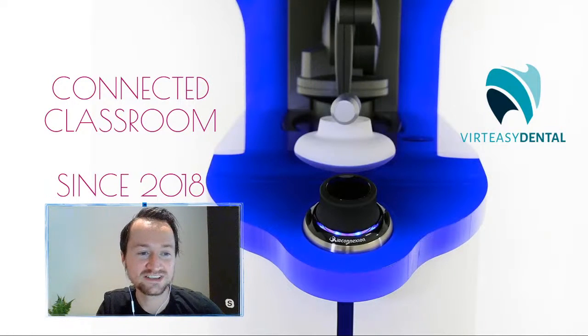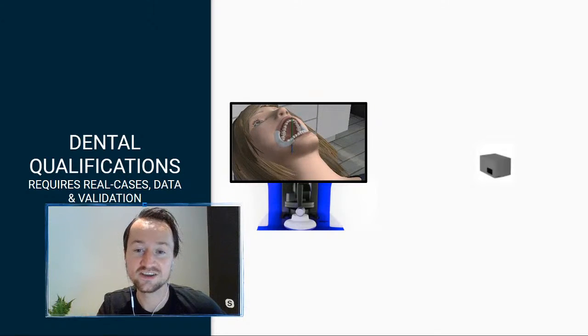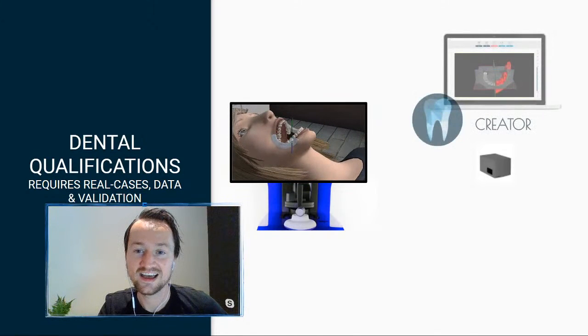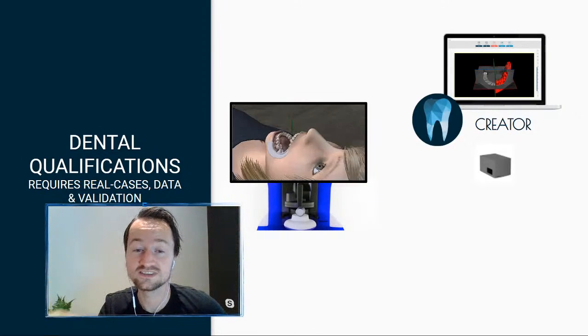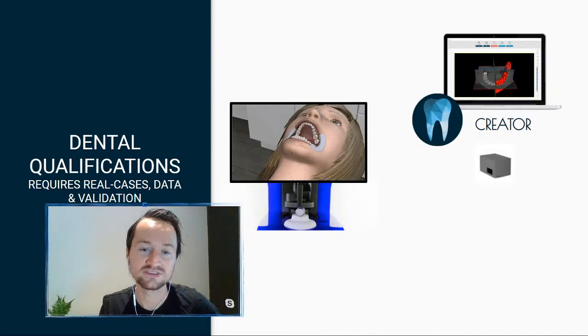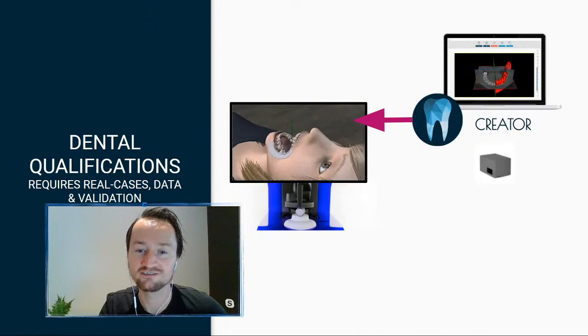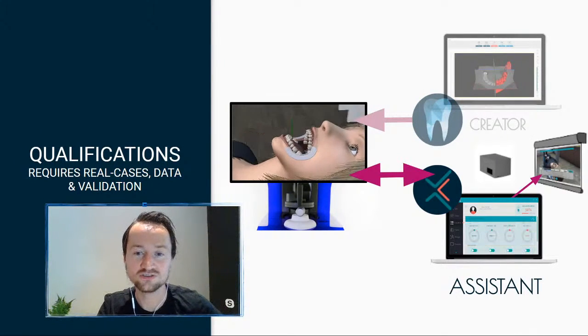We've had this since 2018, and you have a teacher PC and a server. And on this, you have software to create new exercises, like we said, from intra-oral scans, patient CTs, but also from a free library of micro CT scans, everything on there as well. So we've got Virteasy assisting between teacher, student, and grade.